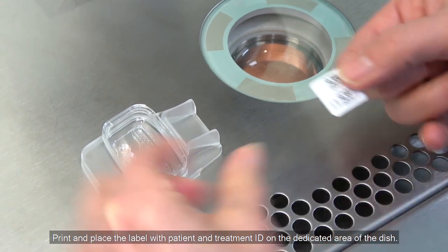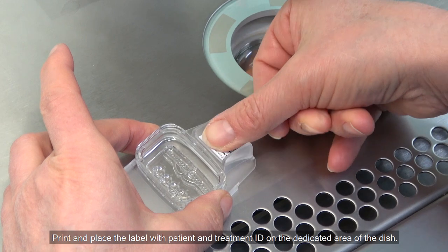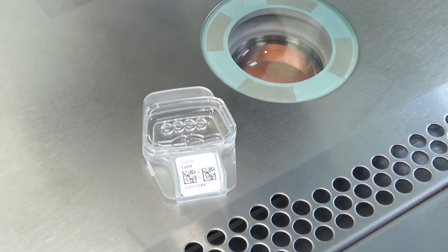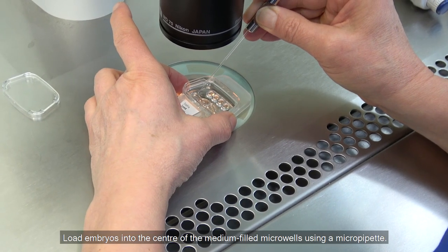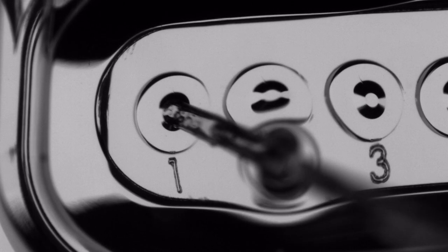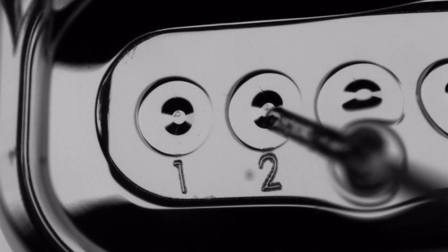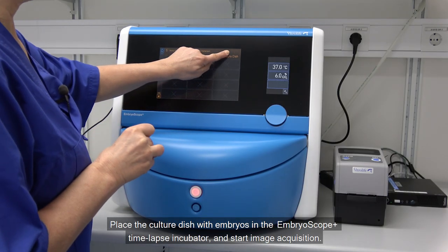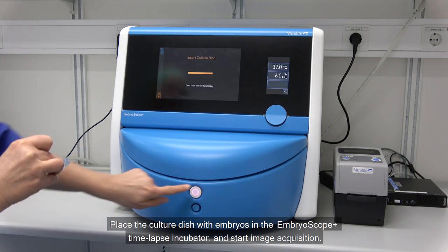Print and place the label with patient and treatment ID on the dedicated area of the dish. Load embryos in the centre of the media-filled micro wells using a micro pipette. Place the culture dish with embryos in the EmbryoScope Plus time-lapse incubator and start image acquisition.